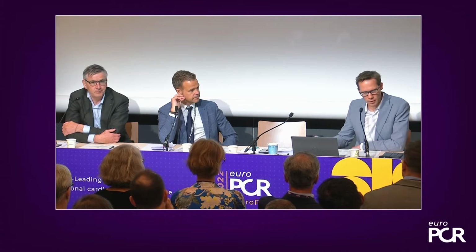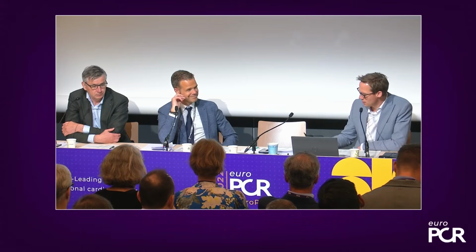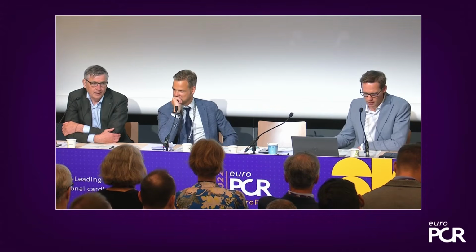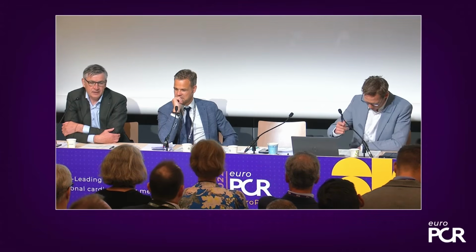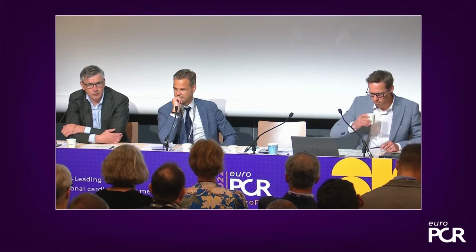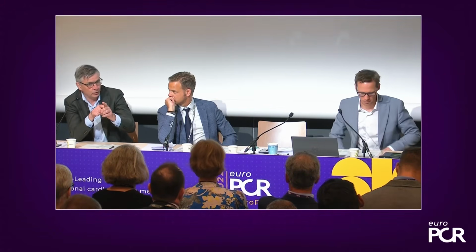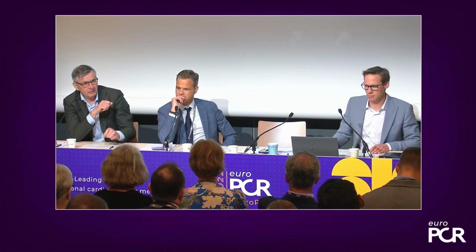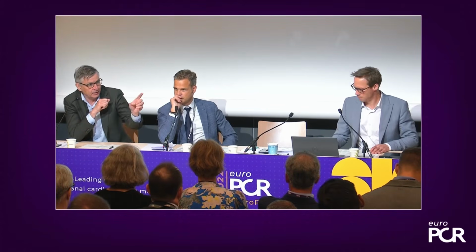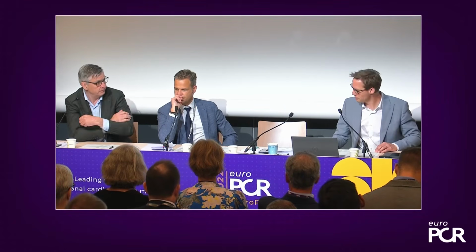Yeah. One technical point that I'm sure people appreciated was that you seem to electrify the transseptal needle to puncture. Is that something you do always, and can you tell us how you achieve that? Yeah, it's actually just a Bovie, as the surgeons use for cutting or coagulation, so we always have that. So when the needle is against the septum, just apply RF energy for a second or two and you'll go through. I think the advantage is that it's not going to slide as you push on it, so you have a more accurate puncture site.